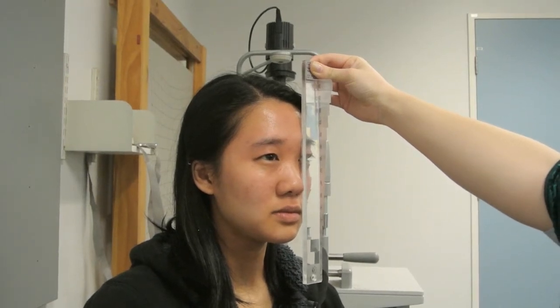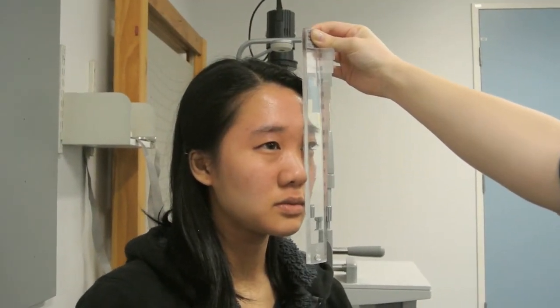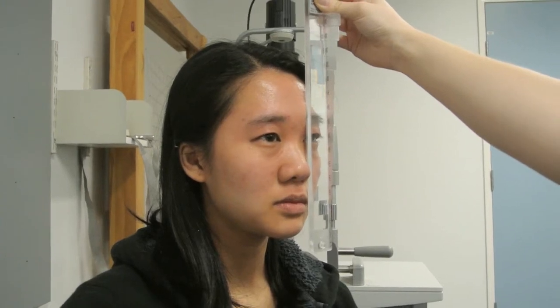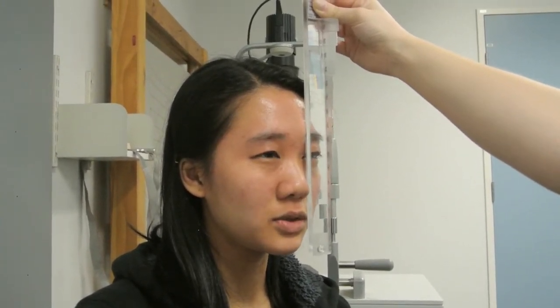Patient has indicated break at 20 diopters. Can you try and make it single? No. What about now — is it single or double? Double. Still double? I'm just going to go back until it's single. Tell me when it's single. It's single. Patient indicates recovery at 5 diopters.